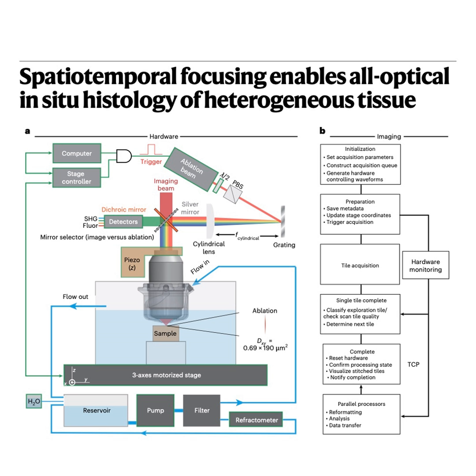Because when you're dealing with complex living systems, vertebrates, standard 3D histology just hits two major roadblocks. Okay, what's the first one? The first wall is heterogeneity. Just think about that skull and brain example. You've got really rigid, dense bone fibers literally right next to extremely soft, delicate neural tissue. Totally different materials. Their optical properties, their mechanical properties, miles apart.